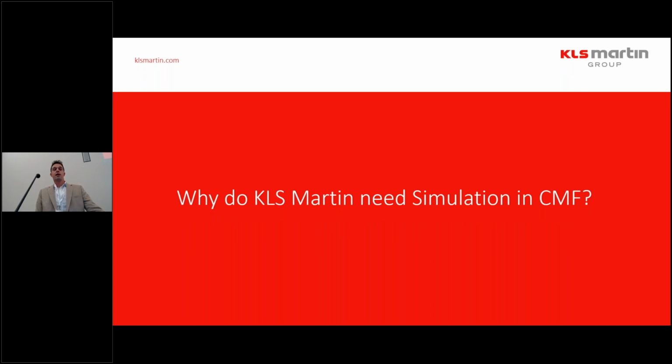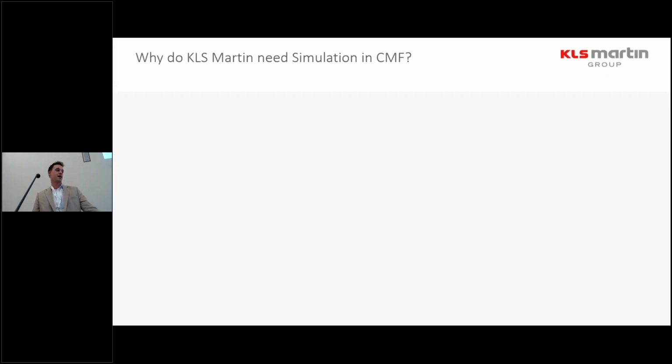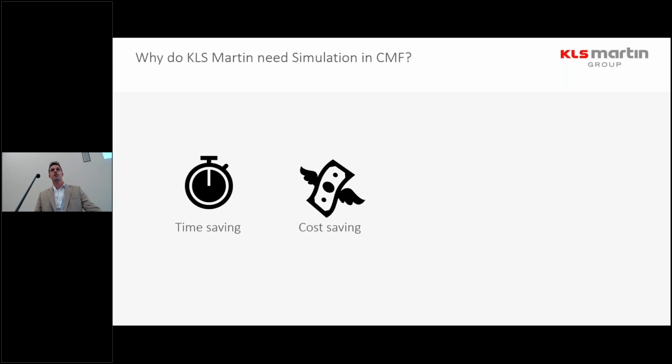So the big question maybe, why does KLS Martin need simulation in CMF? There are different factors, which I already told you in the morning. First of all, it's time saving. I guess I don't need to explain that the simulation is quicker than producing implants and putting them into mechanical testing machines. Therefore, it's also cost saving. We can save resources as we need fewer mechanical testing machines. They are all blocked in our company. Everything we have is fully at capacity. So it's really good to have simulation as another solution to be quicker with our testings.